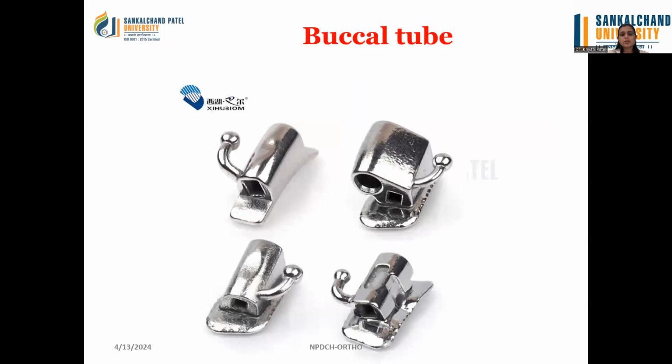Now comes the buccal tube. This is also a passive component in which there is a mandibular. All the four molars have different buccal tubes. Even for the second molar, we have different buccal tubes. In buccal tubes, there is a rectangular slot, and sometimes in the maxilla there is another tube, another slot, also available.